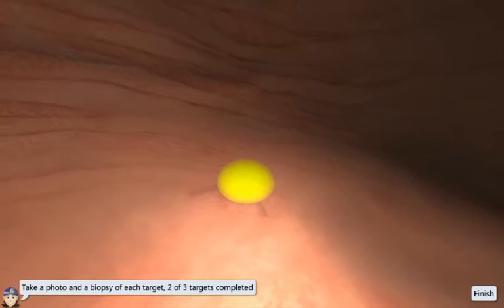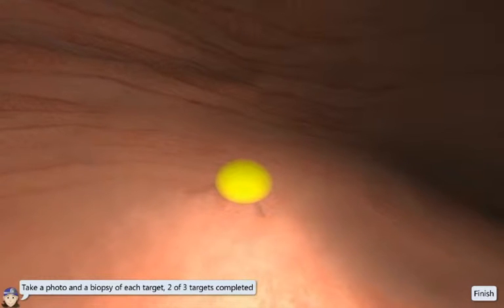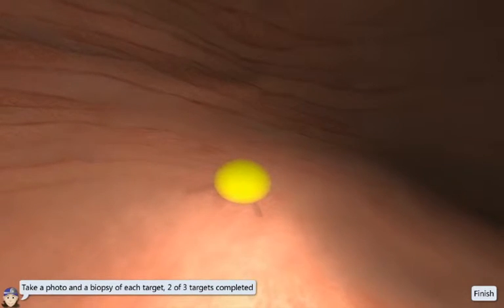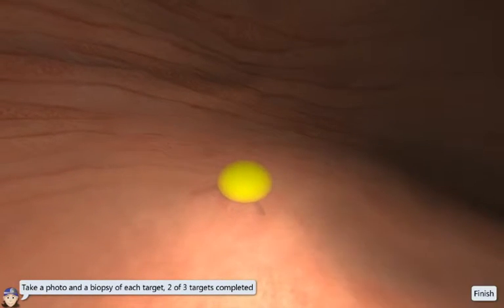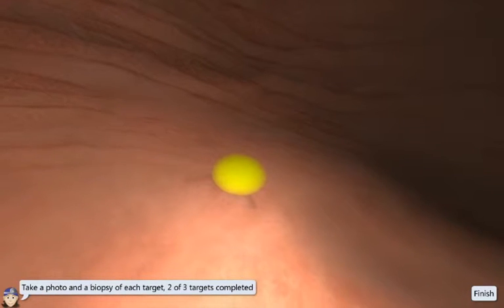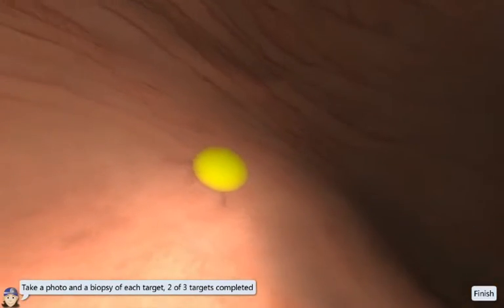To take a biopsy sample from a target, gently insert the biopsy forceps until you touch the target mucosa and take a biopsy with the tool handle.